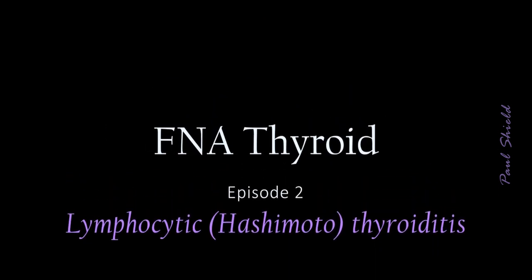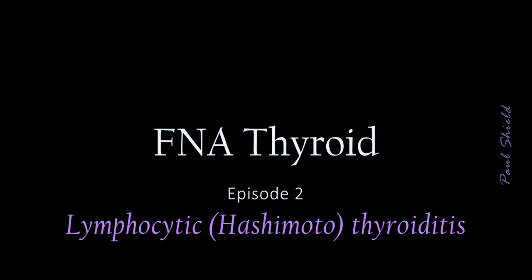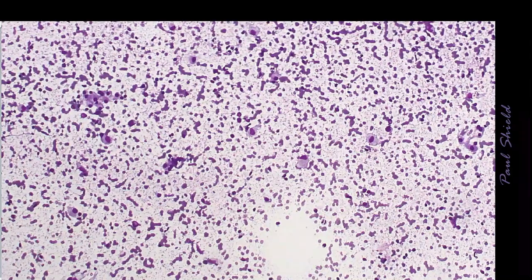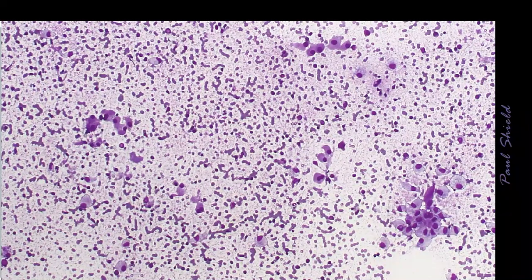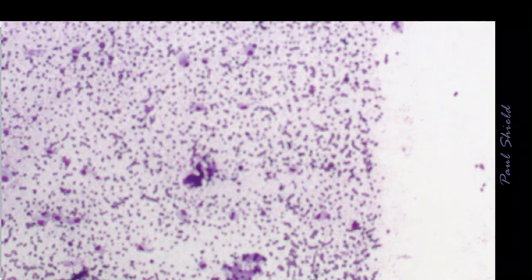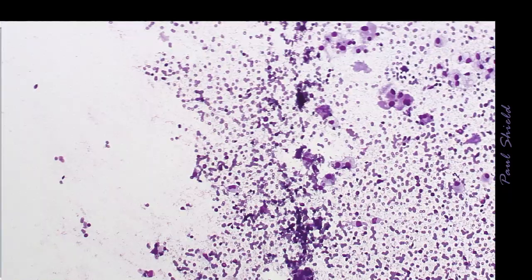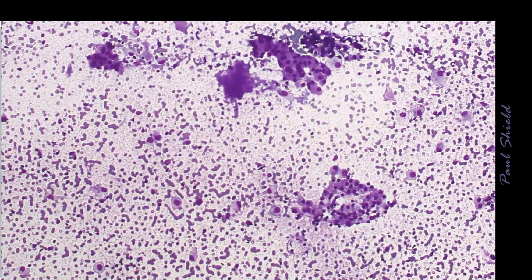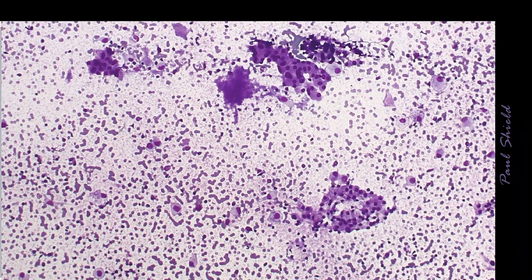Hi everyone, let's look at lymphocytic or Hashimoto's thyroiditis, and I've just got one case here that will illustrate the appearance of these. Here you've got a case, we've got blood in the background, maybe some thin colloid, and then groups of large epithelial cells. What else? Maybe some small scattered single cells in the background, maybe some macrophages.